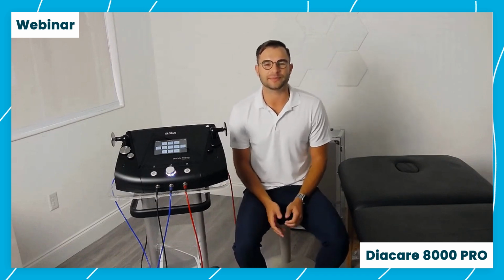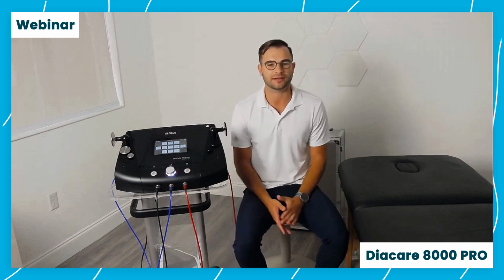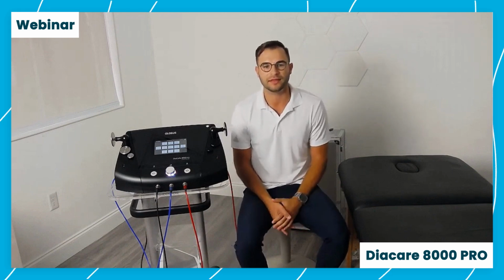I'm Dr. Eric Burman. I'm a physical therapist and a product specialist here at Globus. Today we're going to be taking a deep dive into Diacare therapy, what it is, the therapeutic effects on your patients, and how we're trying to get them better using Diacare therapy, the difference between your capacitive and resistive ways of delivering the waves that the Diacare machine is creating, as well as the different frequencies that this machine is creating and how we're using those frequencies to target different tissues.